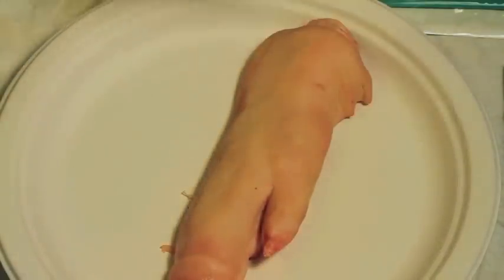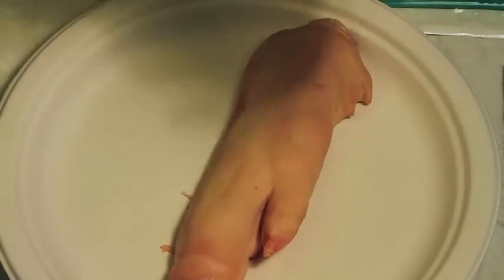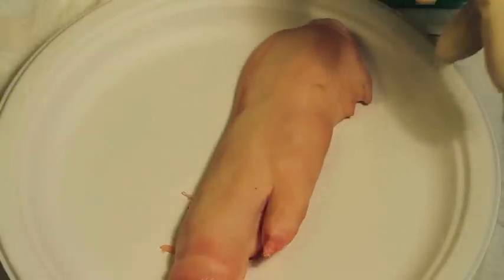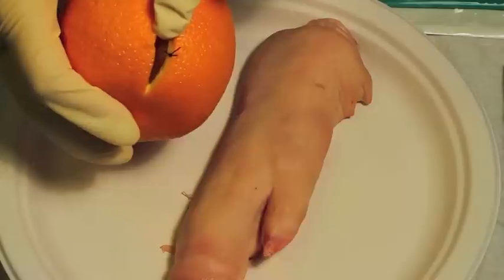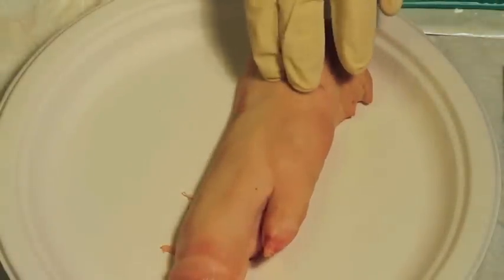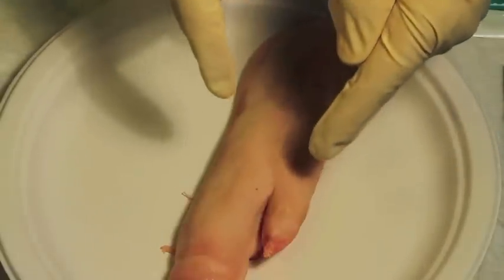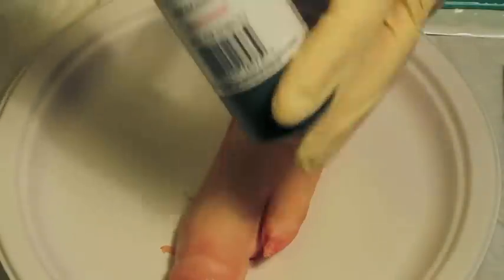This video is going to be about how to suture. We're going to show you everything you need to know to close skin and a little about surgical technique. We're going to use pigskin — pig's foot today. Pig's foot is as close to human skin as you can get, and of course you've got to start by putting on some gloves. You can consider using an orange peel, but an orange peel will just tear through when you tie knots in the stitch, so it is not as good as pigskin. It has the normal texture of human anatomy really — it's a little bit tougher, but if you can do pigskin you can pretty much do just about anything.